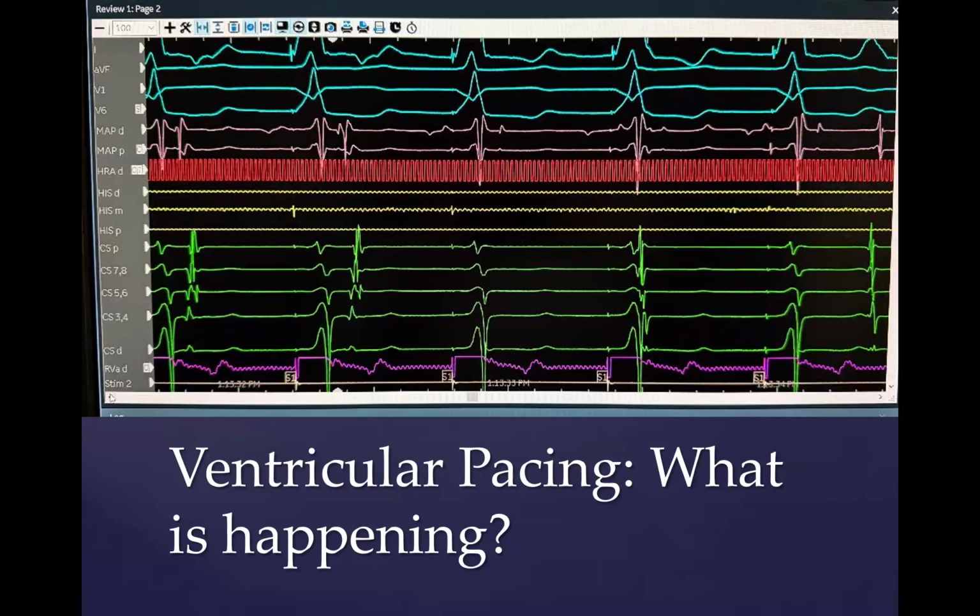But generally speaking, if it goes away just from the touch of the catheter, the likelihood of it staying away permanently is pretty close to zero. So what we would normally do if this were to occur is we would pull the catheter away from this area. In this case, we're transseptal with the ablation catheter. So we would put the catheter somewhere in the mid LA or maybe up towards the left upper pulmonary vein and just sit there during the procedure, waiting for the pathway to recover so that we could continue to map. We would also at the same time look at the CARTO.